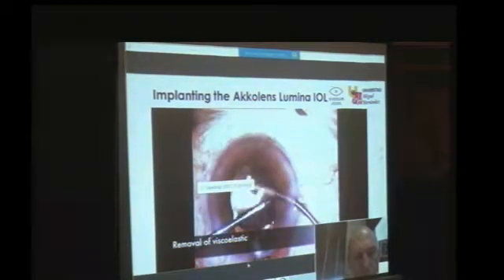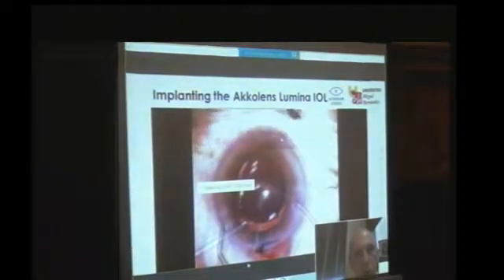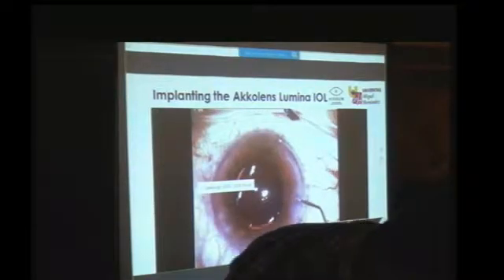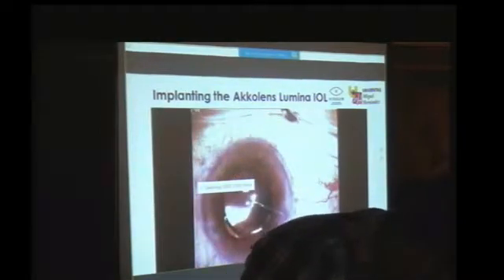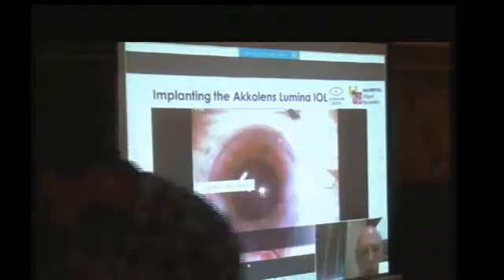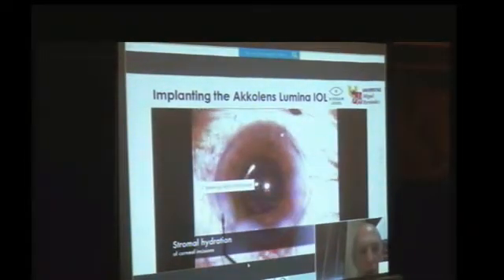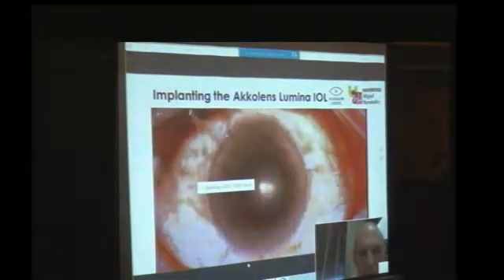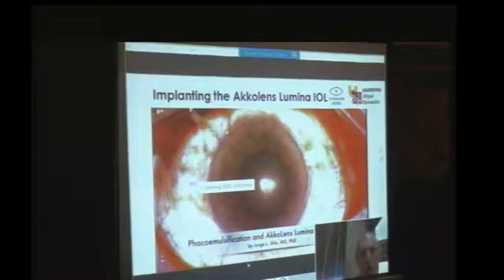Then we clean the viscoelastic. Viscoelastic should be removed from the top, from the bottom, and from the intermediate part of the lens, as far as we have two optical surfaces that should not be occupied by the viscoelastic, and we finish like any normal cataract surgery. So it is a cataract surgery that takes the same time, is not a problem, and you have to be only careful not to trap the haptics in the capsular bag. This is why we do it at 5 millimeters, not larger, which indeed is going to be more complicated.